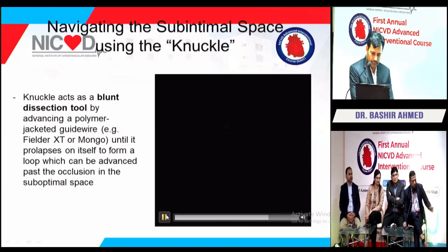Just a quick question from Dr. Hakim. Because I haven't used this Stingray so far, is there any marker there that will tell you that you have to be medial from that? What was your experience? Is that marker helpful or what?